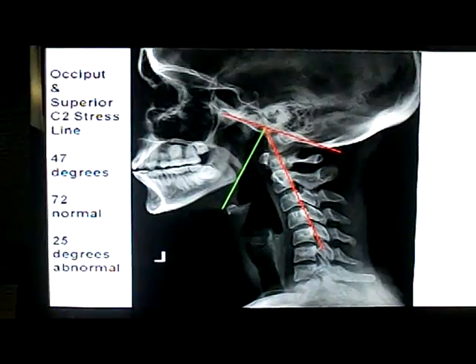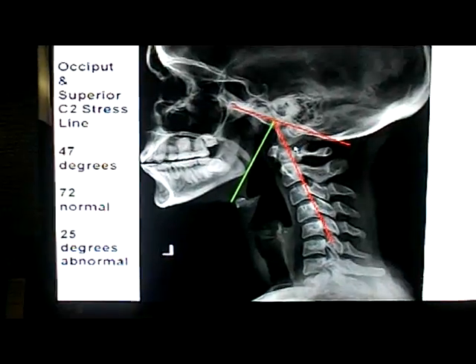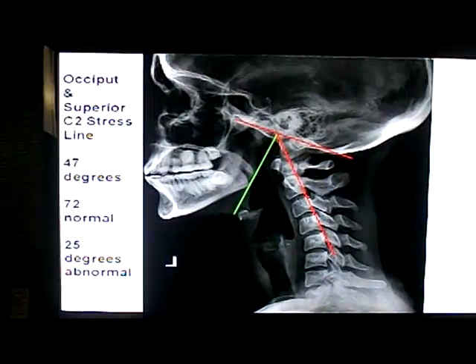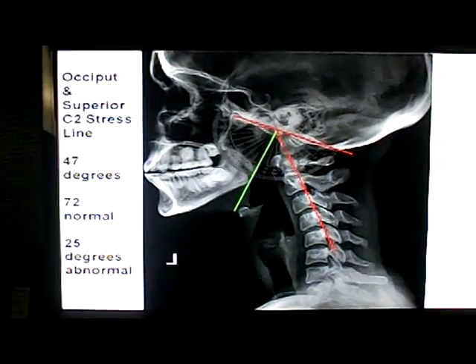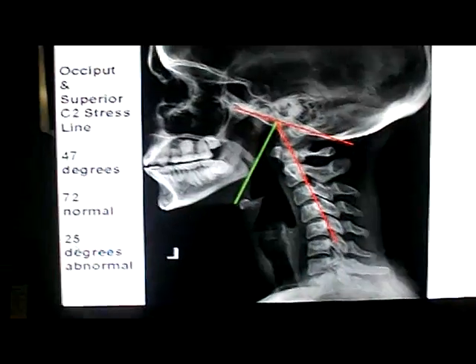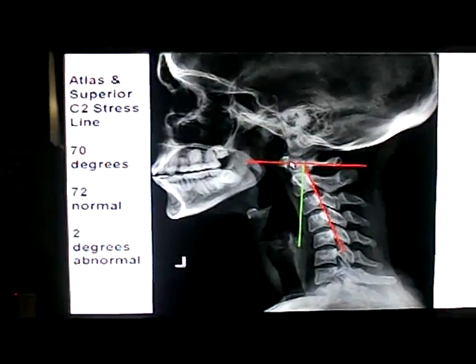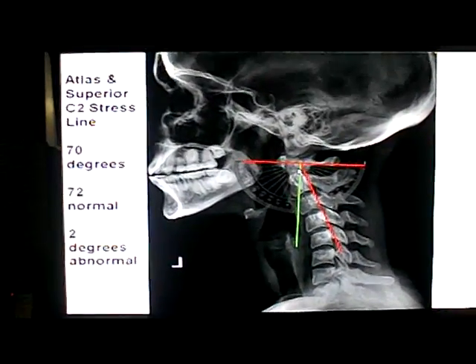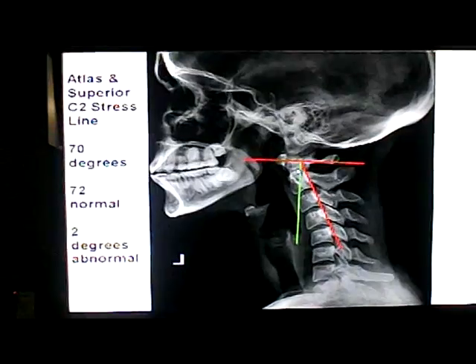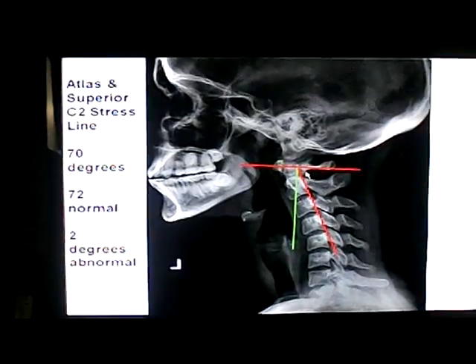When we go ahead and look at the way the occiput sits in relationship to the axis, this is a superior stress line. We look at this on the right side here. What we should see is a 72 degree angle, and this one actually measures 47 degrees. So that means there's a 25 degree radiographic manifestation of the vertebral subluxation in this dimension. The next thing I want to do is look at the atlas in relationship to C2. Here when we measure it, we can see that it actually measures 70 degrees, and 72 degrees is normal in this position as well. So we've got a 2 degree subluxation in this dimension relative to the atlas in relationship to C2.